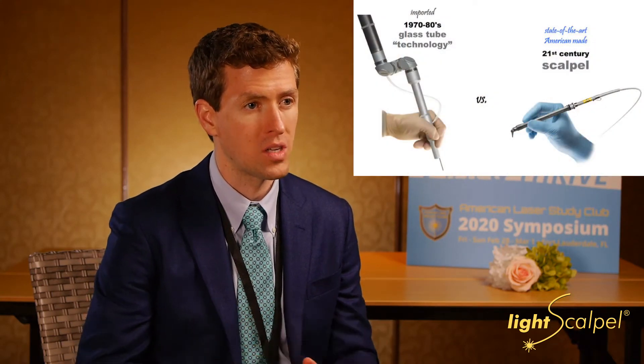So then it comes down to Solea or the LightScalpel. There's also a DECA, which is kind of older and they're kind of revamping now. But for the LightScalpel, the flexible waveguide makes a huge difference — it's much easier to use. I've demoed some of the others; they have an articulated arm and it does seem kind of clunky.